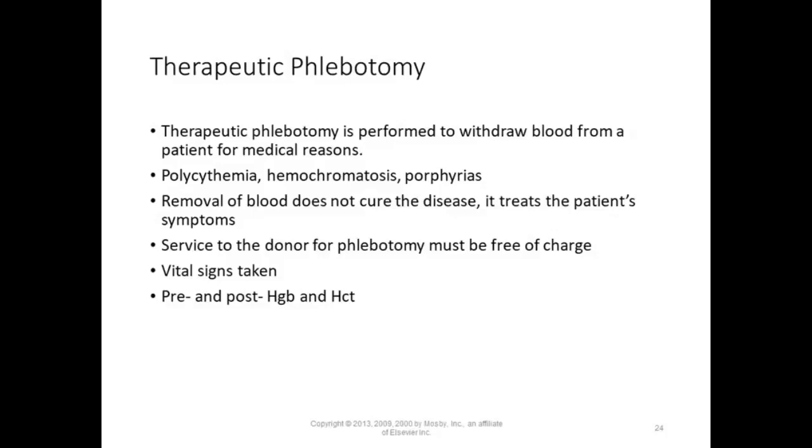If you start feeling bad midway through your donation. But here also is a calculation that can be done to remove the amount of anticoagulant based on weight. I don't know if they would have separate bags. Okay, I guess that's why they say reject you folks that weigh less than 110 pounds. They would have to do math, and they're not doing it. The bags, we're going to talk about that in Chapter 15 as well, the different additives and things like that.